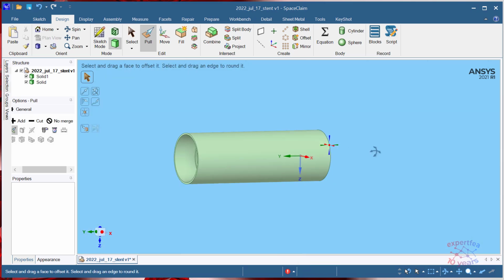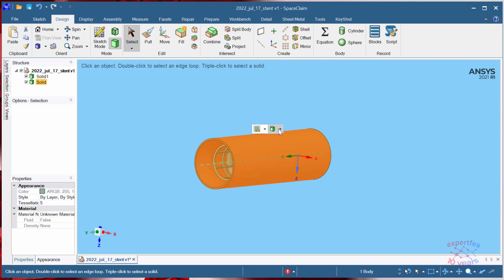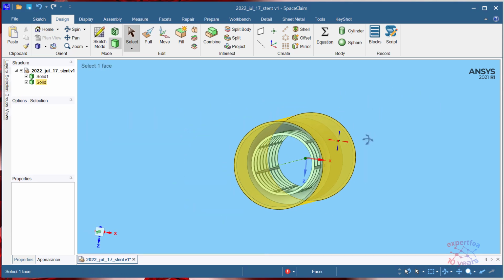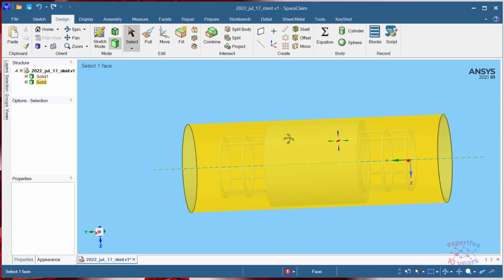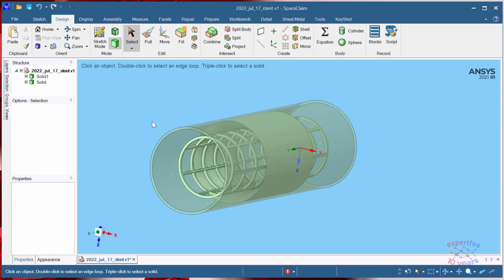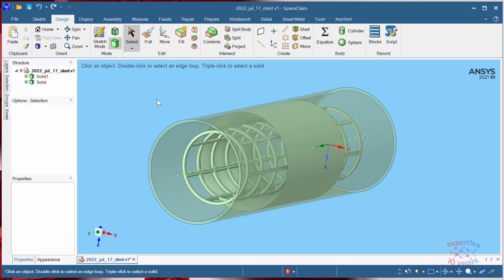No problem. Let's triple click the blood vessel. We also have this option to make it transparent, and we can see here what's happening. So this is the geometry part. We will move to the simulation part in the next step. Let's save.